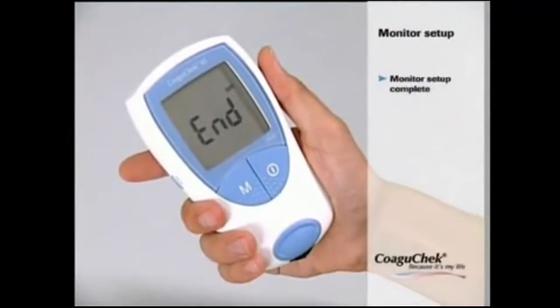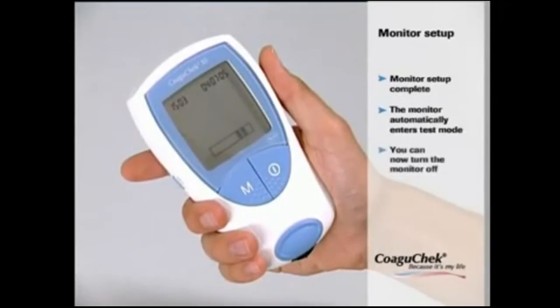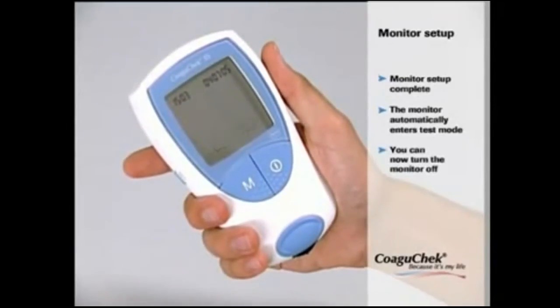As you can see on the display, the setup procedure is now complete, and the monitor automatically enters test mode. If you don't want to proceed with testing, you can now turn the monitor off.